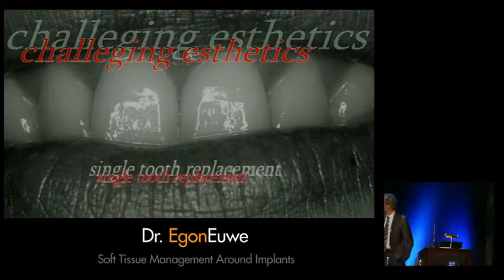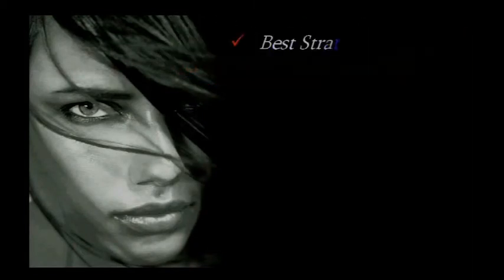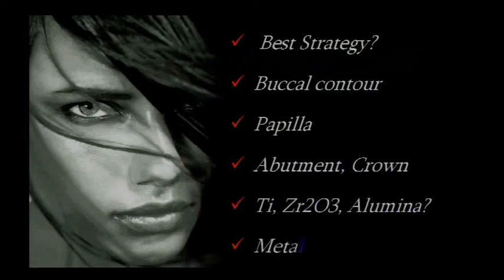with all these components. So if we limit ourselves to single tooth replacement, the strategy is important, the buccal bone, the papilla, the abutment crown combination. Nowadays we have a wide choice of aesthetic materials. We can still use titanium, but zirconium and alumina are very often used. And when do we have to go for these metal-free solutions? I will give you some brand new data on that as well.